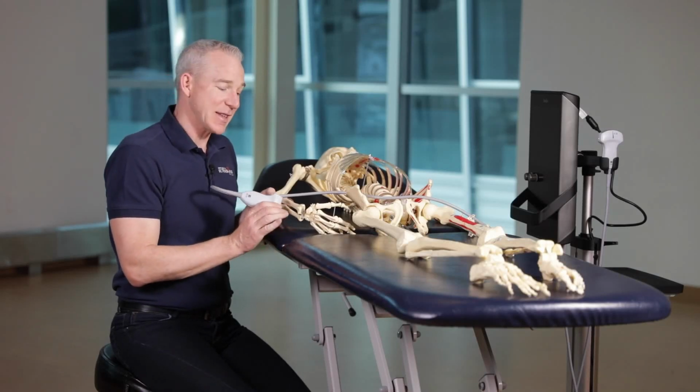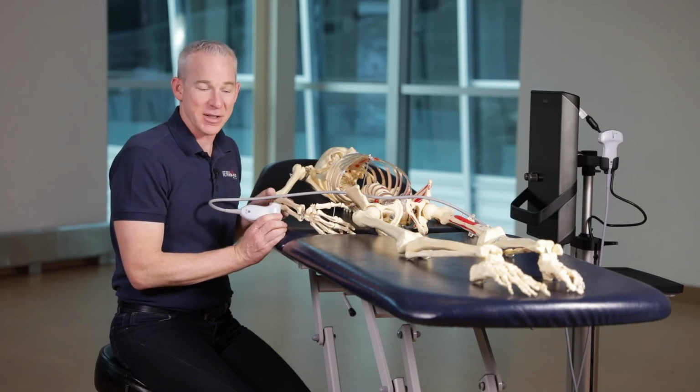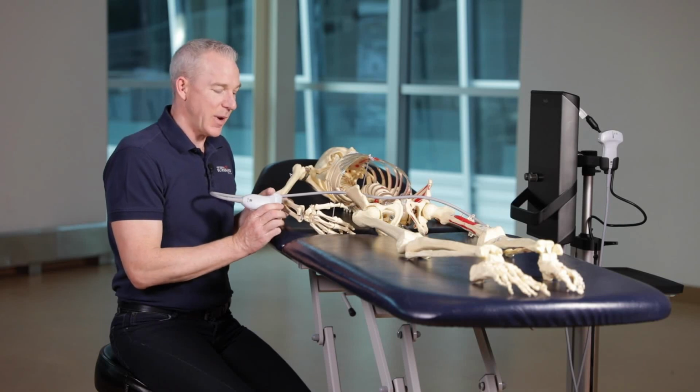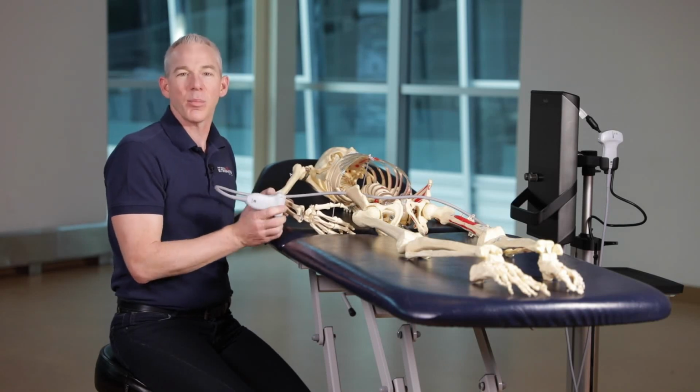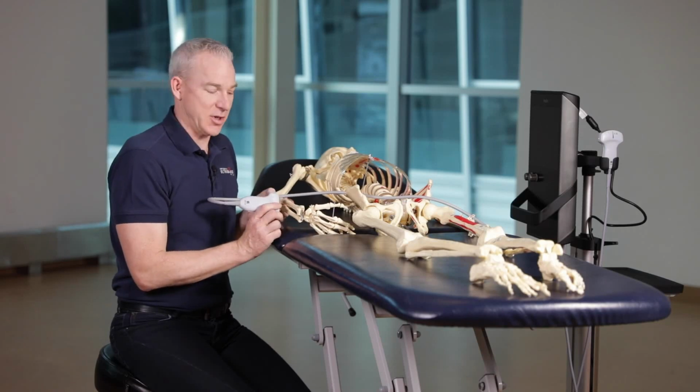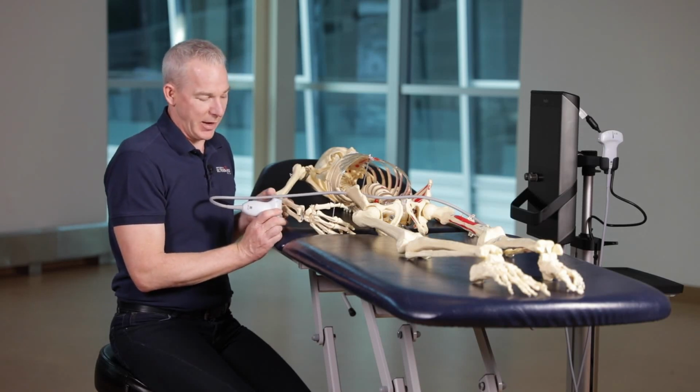I'm going to show you how to scan the first extensor compartment of the wrist. It's a location where we get de Quervain's tenosynovitis. The patient position is supine with the thumb pointed up at the ceiling. So the skeleton model, we've got the wrist quite flexed just so the camera can see this a bit better.